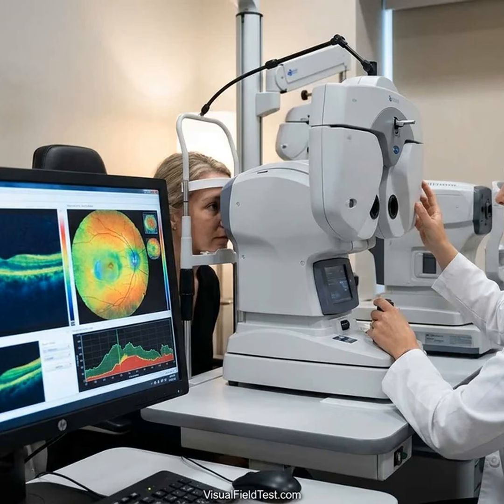Advanced glaucoma. In severe cases where OCT has limited use, floor effect, imaging may be done less often for glaucoma purposes. Some experts say every 6 to 12 months or as part of routine visits. If doctors are instead focused on macular changes or other disease, they might still use that same schedule. However, any hint of new vision loss might trigger an immediate scan to evaluate the cause.